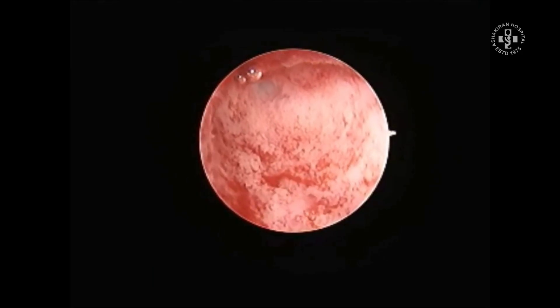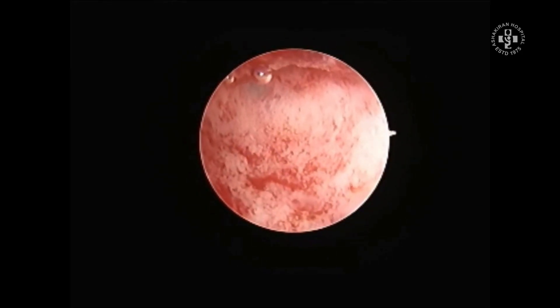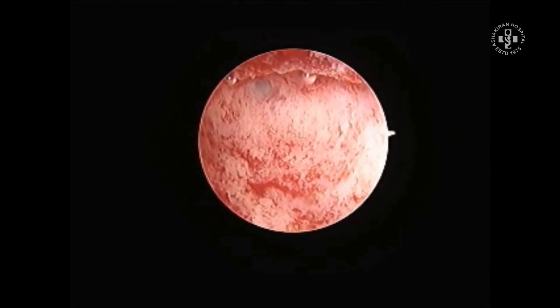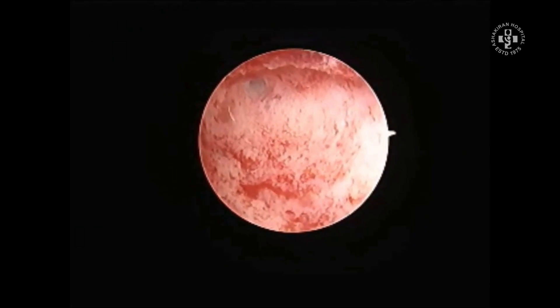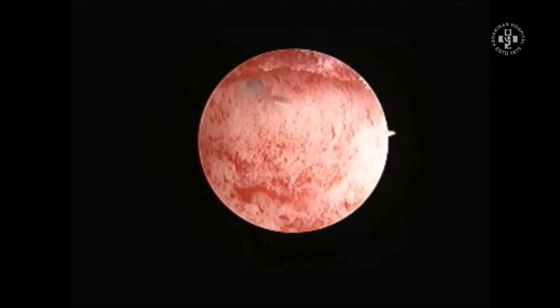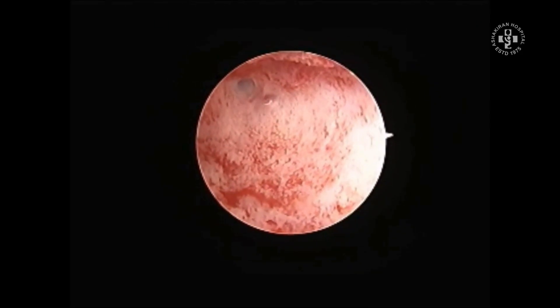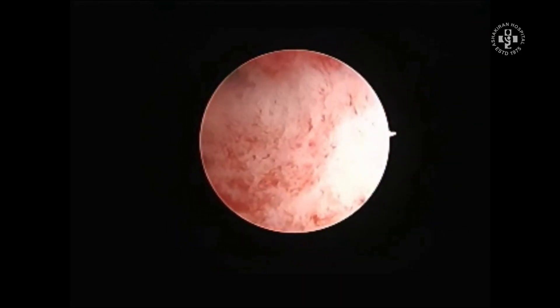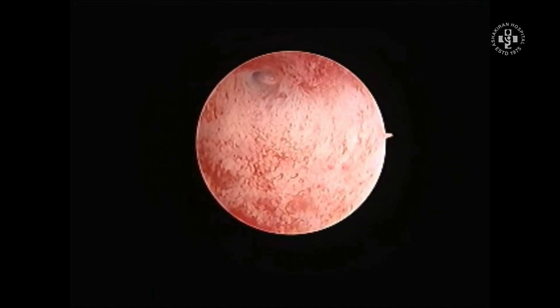Here we are going to show you a different test — the bubbles test. You can see the bubbles are being sucked up into the ostia, and this shows that there is tubal patency, which has been documented. So this is another test which will tell you about tubal patency — bubble testing.